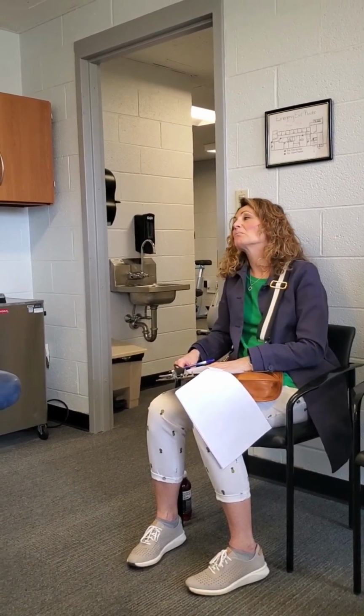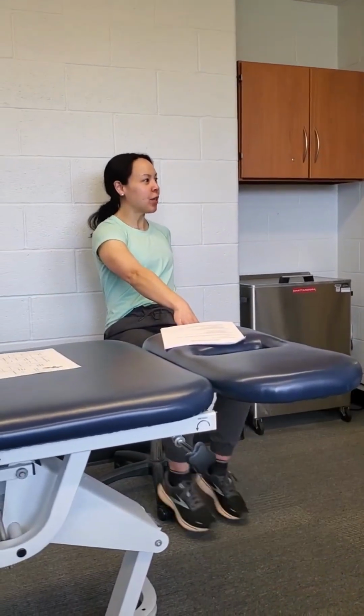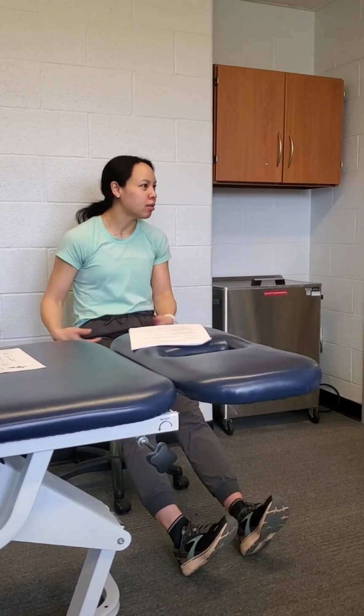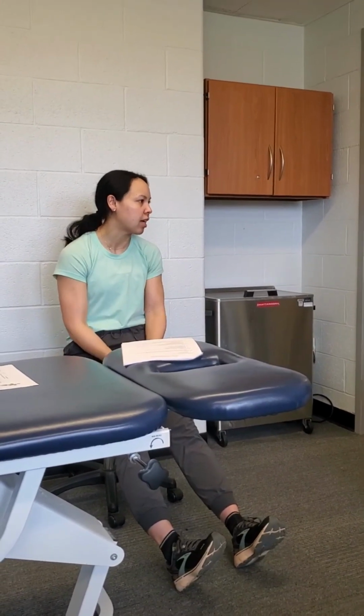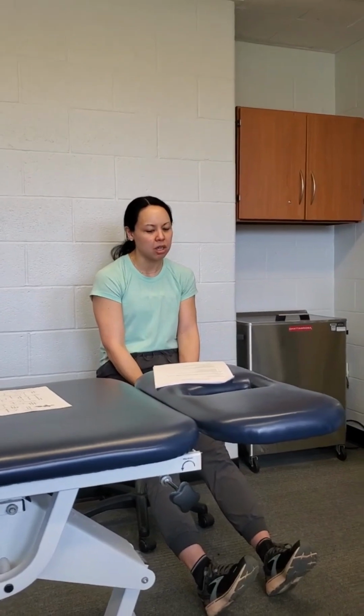So even if you're doing it on a side that's weaker, it will have a crossover effect on the other side. And in that study, they literally just did bilateral knee extensions 3 times a week for 4 weeks and showed gains. So if you had time, you could do both sides. But if your time is limited, I would probably do it on the weaker side and know that there's some crossover effect. And you're still working both sides with the exercise. So yeah, it is very interesting.